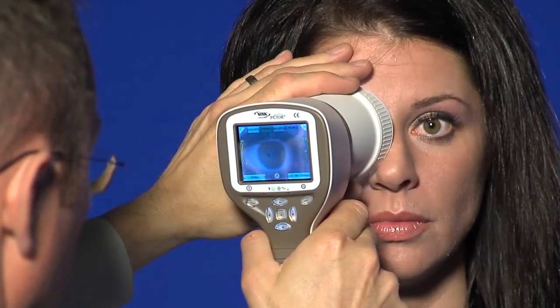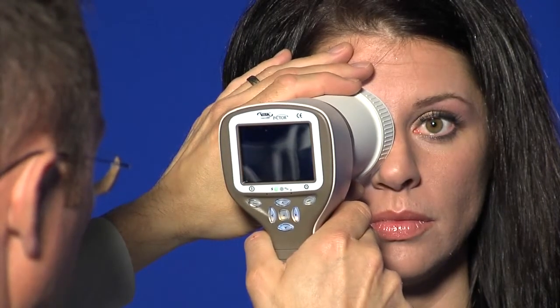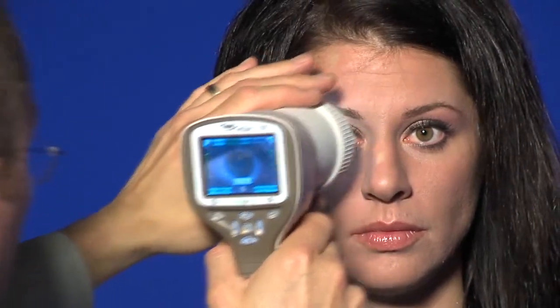The still image is captured by pressing the shutter key all the way down. If in video mode, video is captured by keeping the shutter down.